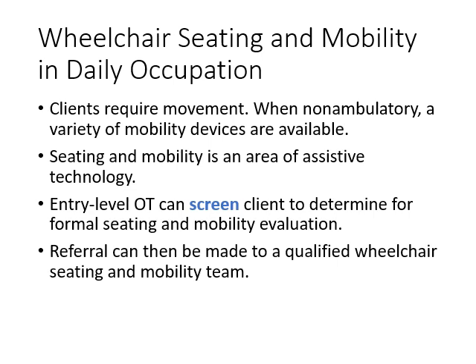Now, seating and mobility is an area of assistive technology. An entry-level occupational therapist can screen the client to determine a need for a formal seating and mobility evaluation. If a client is screened and found to require a new wheelchair, a new seating system, we're going to refer them to a qualified wheelchair seating and mobility team.